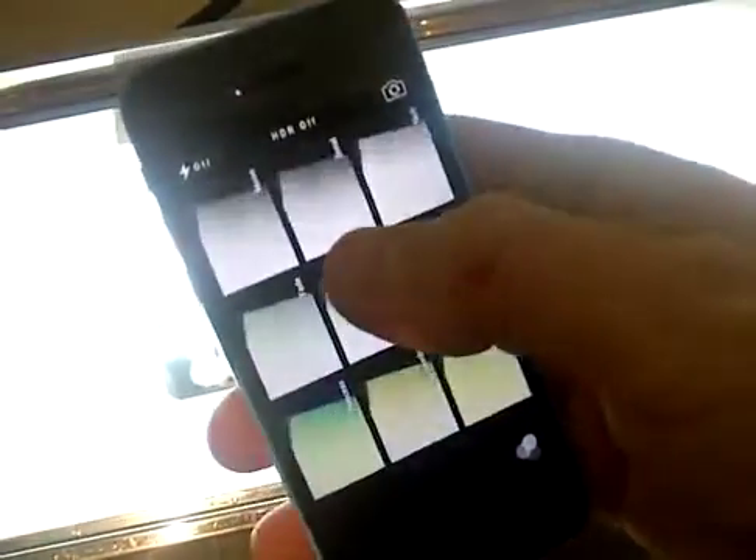Let's get back to the camera. One thing you have to do is zoom in. I'm trying to do this with one hand — it's a little tough — but you're going to zoom in using a two-finger expand gesture. Then you go down to this button and choose mono — monochromatic — because you don't need the color information for x-rays when you're taking a picture on an iPhone.